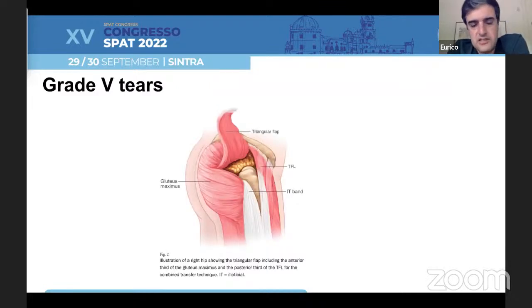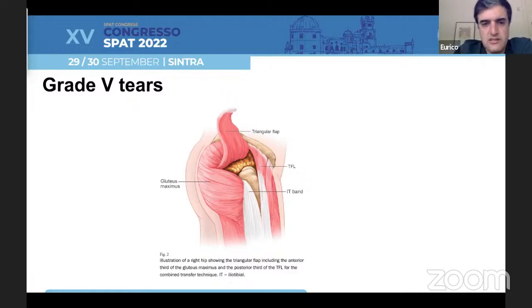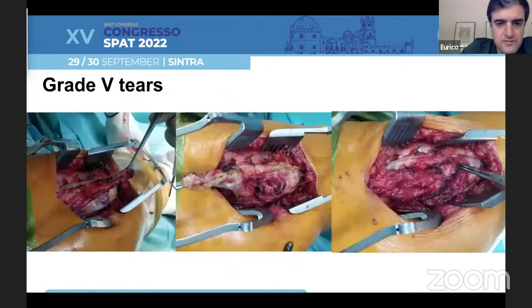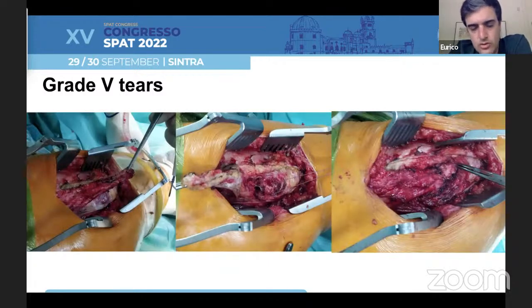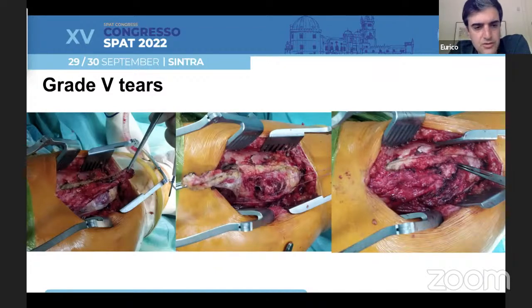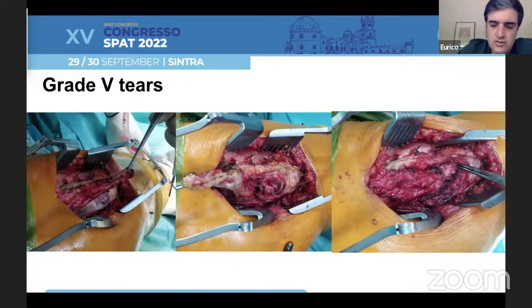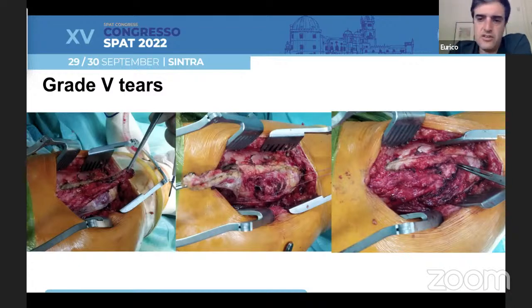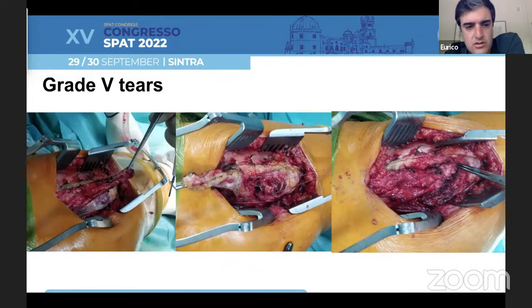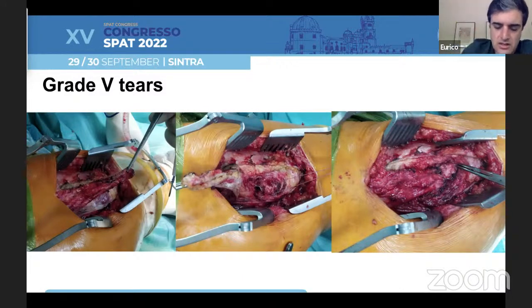For grade five tears, I am doing this surgery open. We take a triangular flap from part of the gluteus maximus and part from the tensor fasciae latae. This is the case of a patient who has a total hip through a direct lateral approach with damage to the abductor tendons. We just took this flap from the tensor fasciae latae and gluteus max, put it through the defect, anchored it with four peek anchors, and then we close the limbs of the flap over the flap that we left, suturing the remaining tensor fasciae latae through the remaining gluteus max.